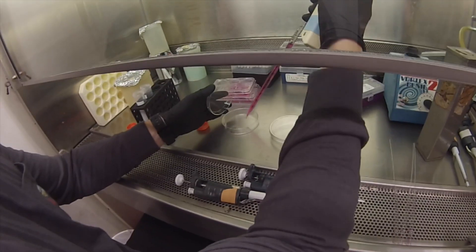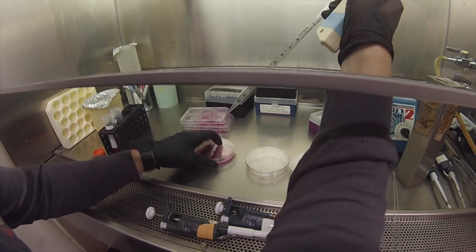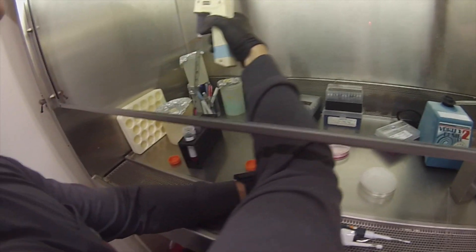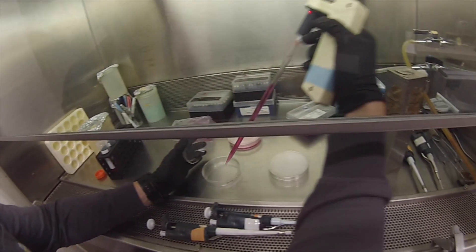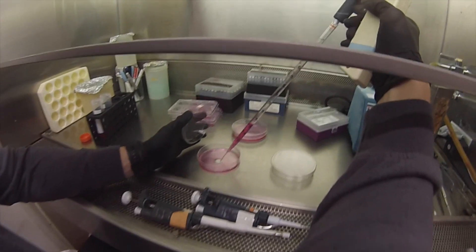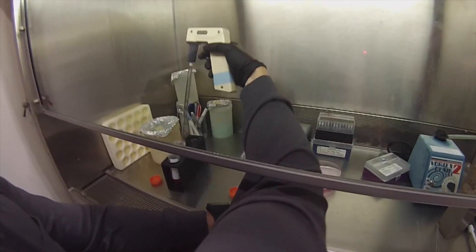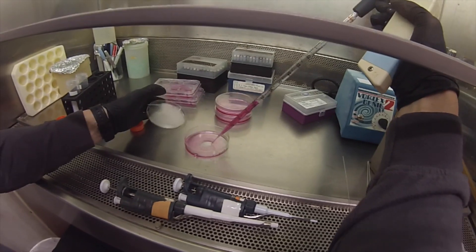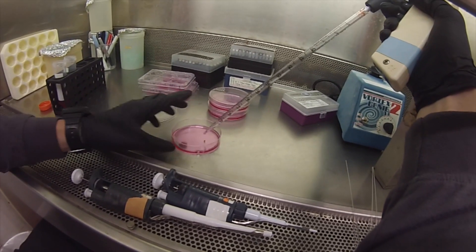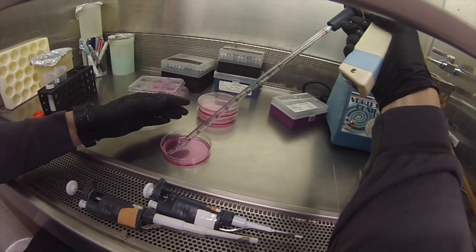So this is 110. There's a bubble right here — that's not good. So we take this and the bubble's gone.